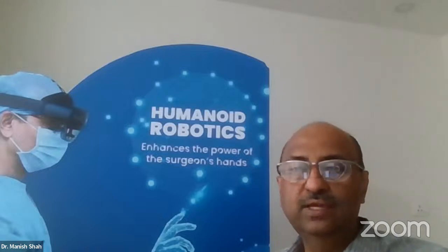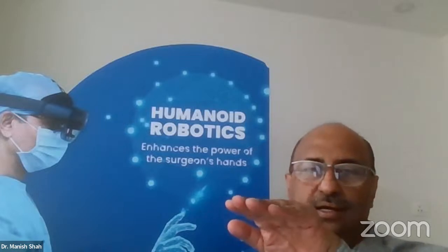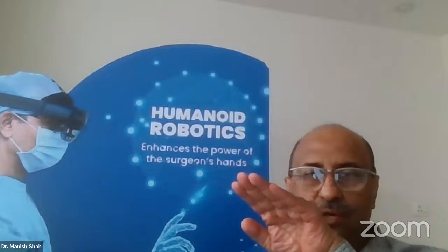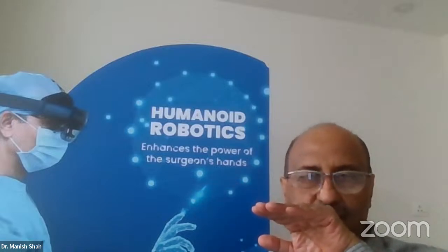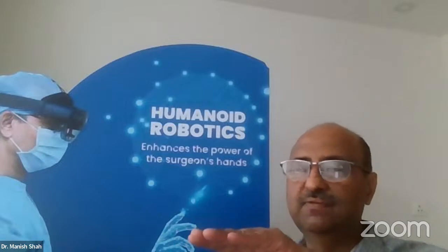One was, how do we reduce cutting errors through alignment techniques in TKR? One of the safer techniques to follow is that we normally take the anterior chamfer before taking the anterior cut, so that if you happen to notch or you are about to notch, you will be able to pick it up much earlier. When you're going with the anterior cut first, quite often you do not know where the blade will exit.